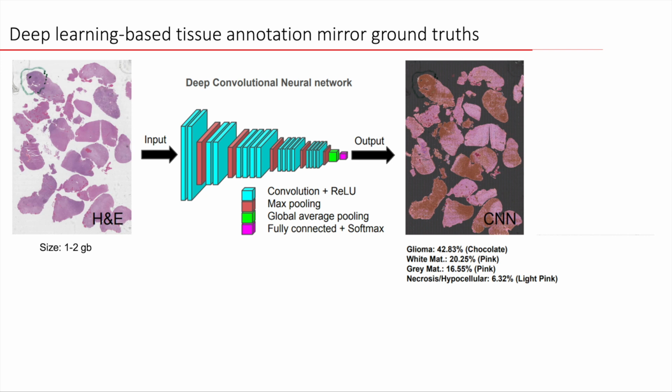Just to show you how precise this can be, this is a section of a glial tumor, and you can see that the tissue has been fragmented into many tissue components. We run this slide through the neural network trained to recognize specific properties that are of diagnostic value for glial tumors, and you can see that it only found the glioma in certain components of this slide.